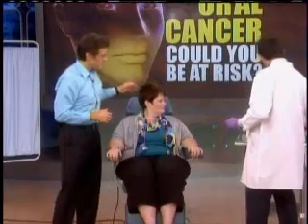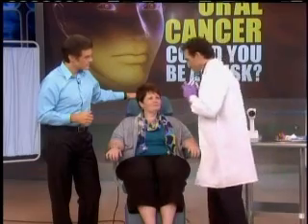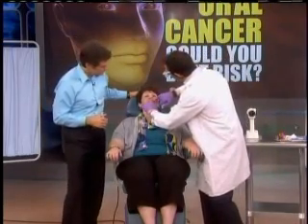So the first oral cancer screening test is something we're going to talk about called the Velscope. But before you show me the Velscope, can you just show us what an exam looks like fundamentally? Okay. So our normal examination, we really want to look at all of the soft tissues in the mouth. So I'm going to put my loupes on. Please put your head back a little bit. Open for me.